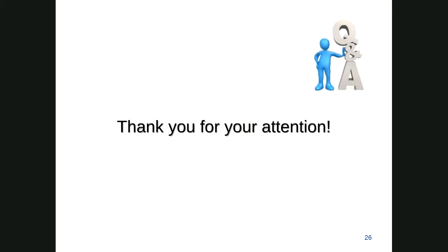Okay, great. And also Zora has their hand up. So could you unmute your microphone, Zora, to ask a question? Yep, thank you. Thank you, Dr. Amjadi, for your great lecture. I was just wondering, you said that you didn't see any skin irritation because of the air circulation that you have under the patch. So is that because of those micropillars that you put under the adhesive layer? And also, when you add the sensing layer on top of it, does it have the same biocompatibility with the skin? Or does it collapse or something like that?